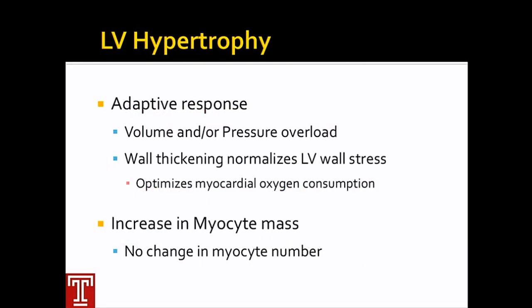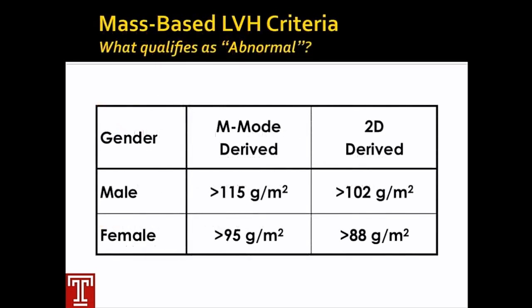LV hypertrophy is an adaptive response. We've already mentioned that. You see it in a number of pathologic situations, and it's very important that we should be able to tell our colleagues in heart failure, our colleagues in the valvular heart disease department, etc., how severe the LVH is, and as we'll see in a minute, what kind of LV hypertrophy it is, to really help care for our patients. And you will be expected to know these differences on the exam.